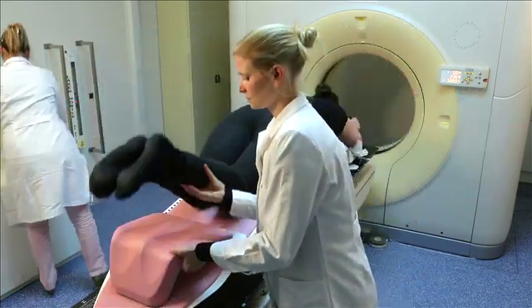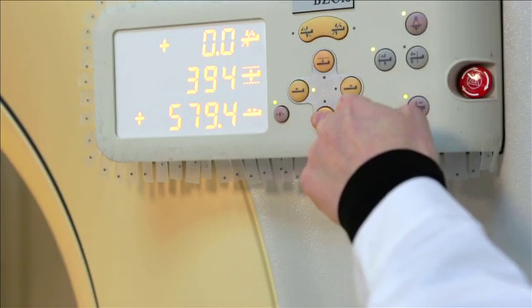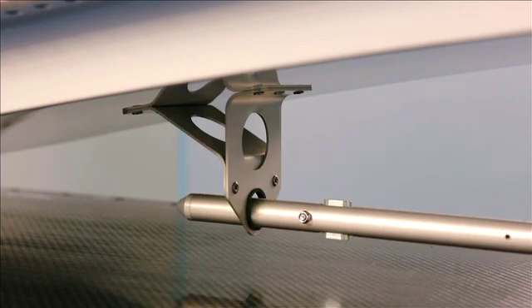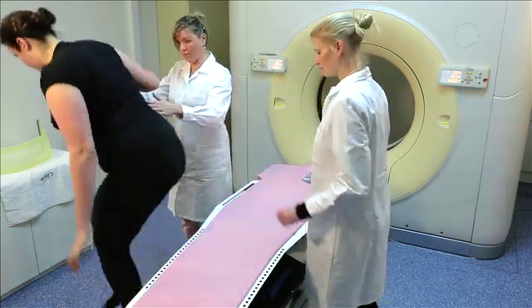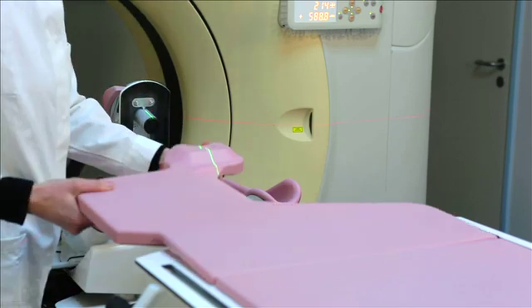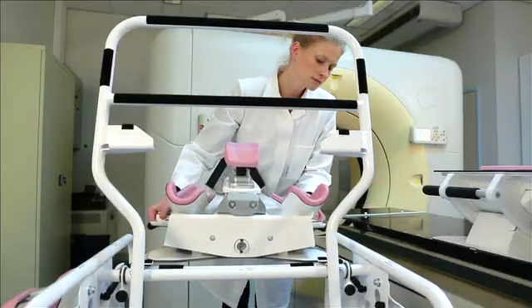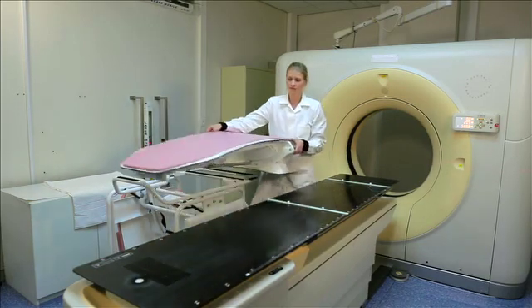Remove the foot support and lower the table. Pull the metal shaft backwards again so the Sagittilt stays in place when the patient is stepping off the system. Help the patient to step off the Sagittilt and store it on the storage cart. Dismantle the system by opening the forehead support and taking out the breast bridge. Position the cranial and caudal parts on the cart and slide them underneath the clamps to lock them.